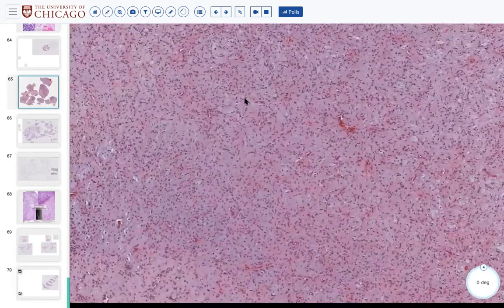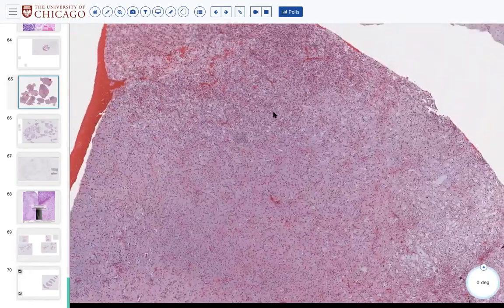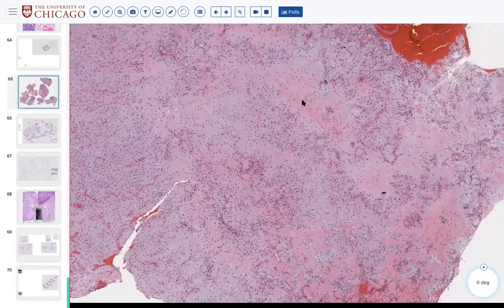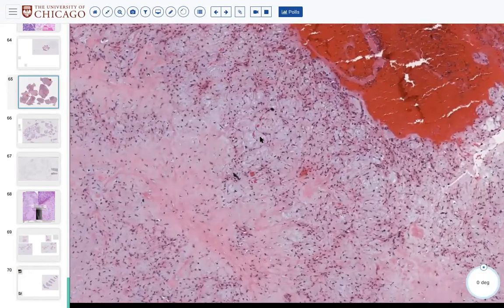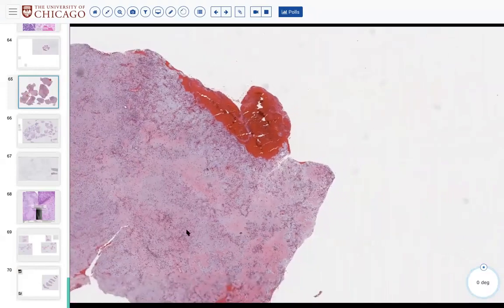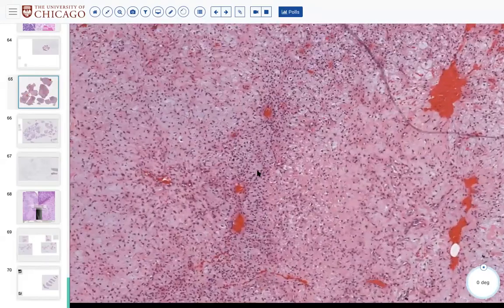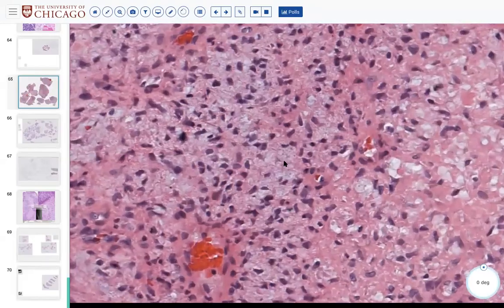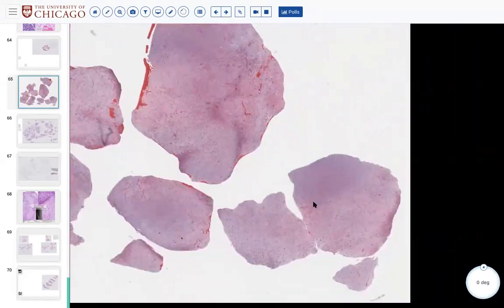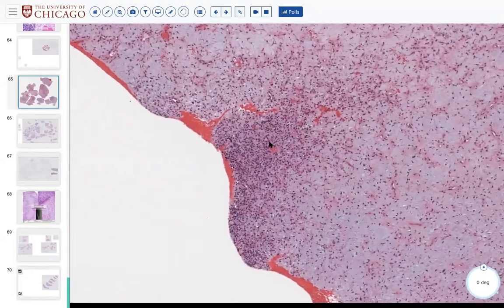Oh yeah, Ben, while we drive around, did you also want to comment on what you found out about BRAF from last time, about the EG and the LCH and the mast cells? Sure. If you guys remember, we were talking about the BRAF IHC and how sensitive it is in Langerhans cell histiocytosis. For some reason, I was thinking that it wasn't very sensitive. I'm not quite sure where I read that. It might have been from an old boards review book or something.